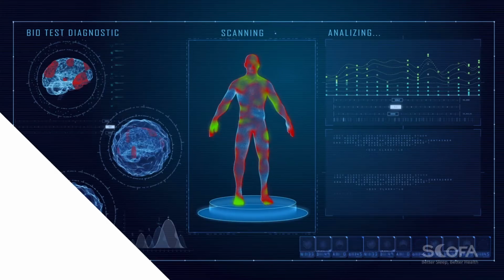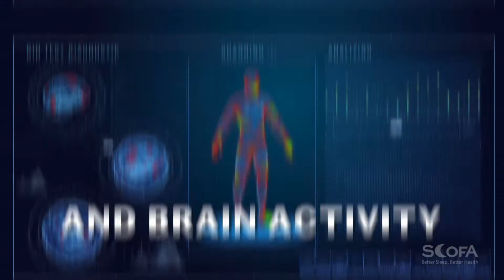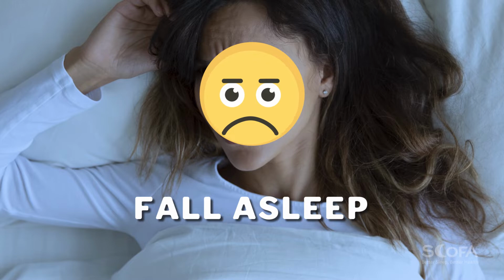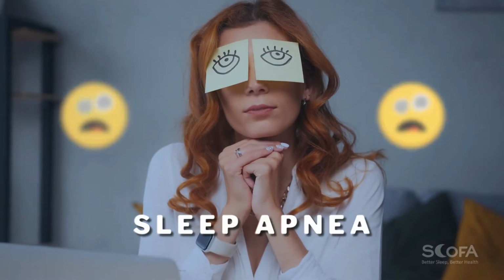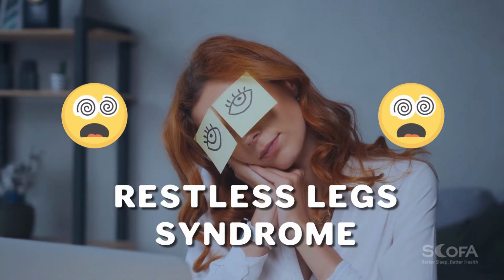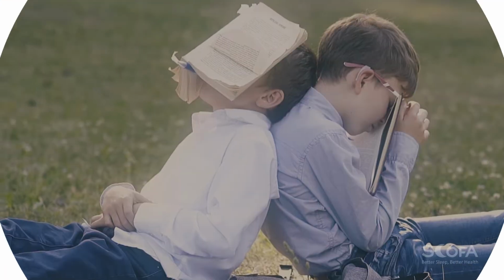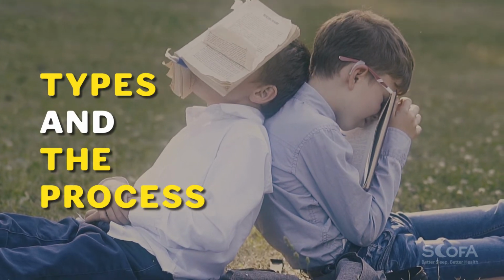A sleep study is a test used to monitor your body and brain activity while sleeping, including how you fall asleep and when you wake from sleep. It's used to diagnose underlying sleep disorders such as sleep apnea, insomnia, narcolepsy, and restless leg syndrome. In this video, you will be learning about the types and the process of a sleep study.